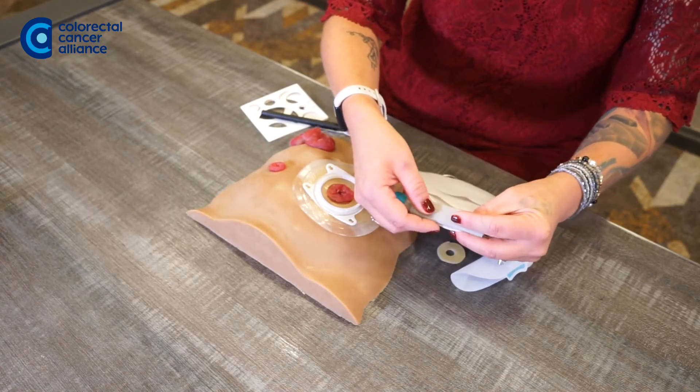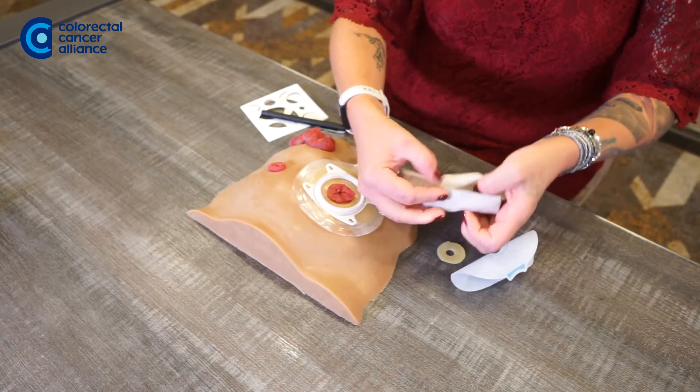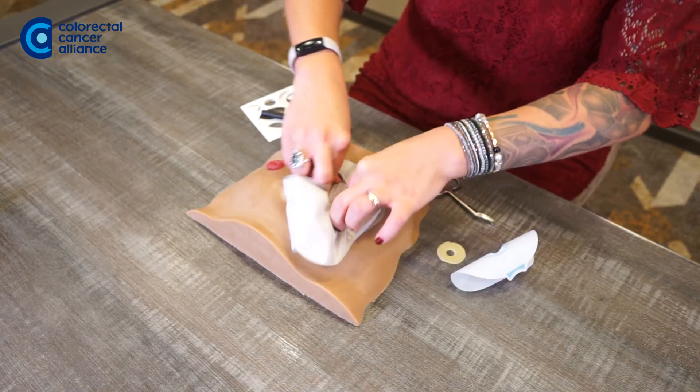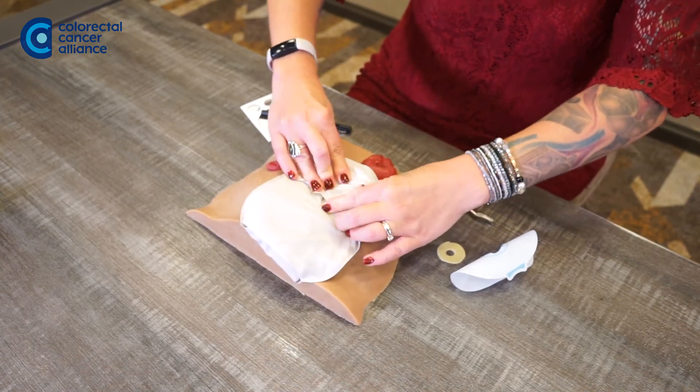Make sure that you do close the bottom — you don't want to get any leakage. This bag has an extra little velcro so you can tuck that in. And then you're just going to pop that bag on, and there's your bag.